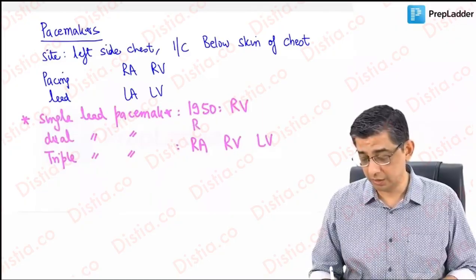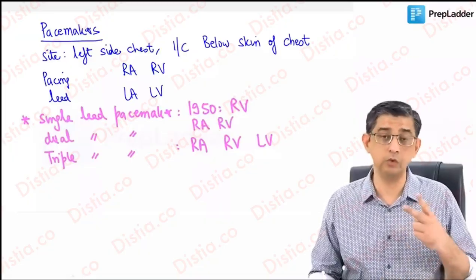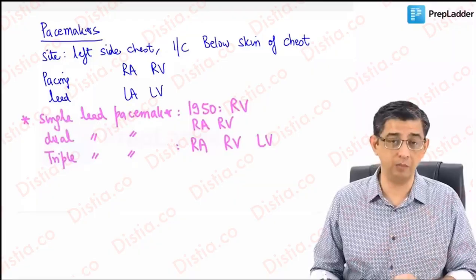Dual pacing will control the right atria and the right ventricle, and I've already explained to you that dual pacing will be used where there were two pacemakers malfunctioning and messing up with the situation. That was third degree heart block, also called complete heart block.